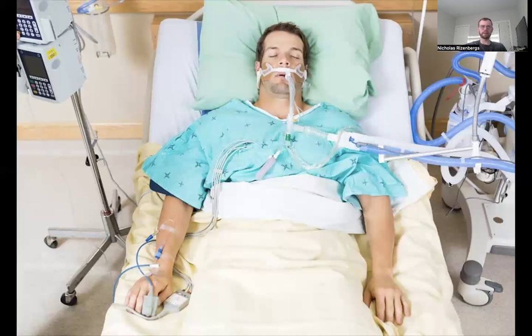And I want to make sure he has an adequate PF ratio of 150 to 200, PEEP less than 5 to 8, for FiO2 less than 50 to 40%. Now, if he's on 50%, I would like his PEEP to be around 5. And if he's on 40%, it's okay for his PEEP to be up to 8.